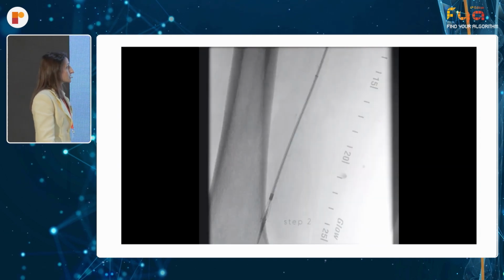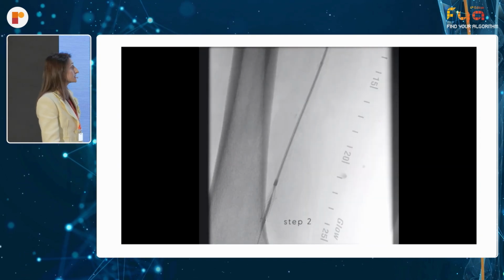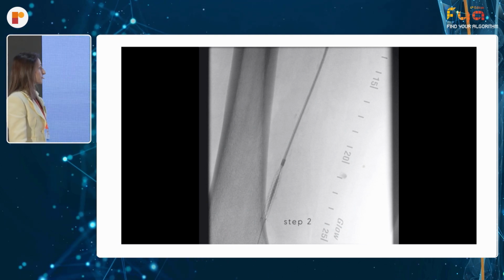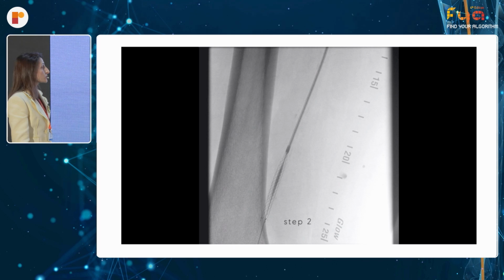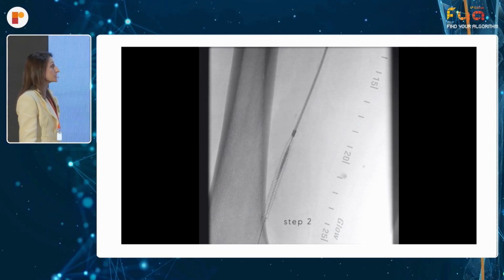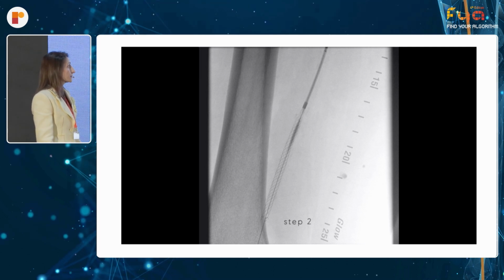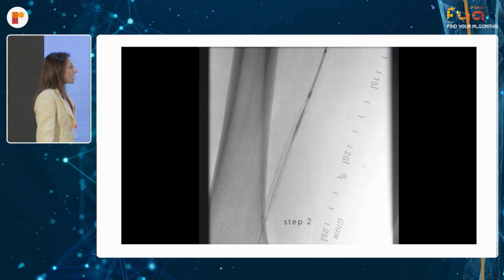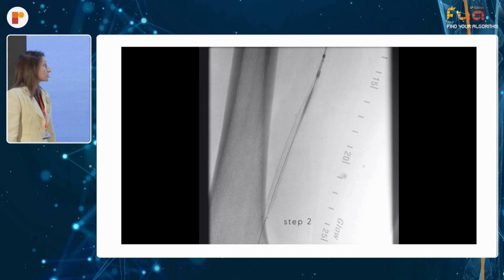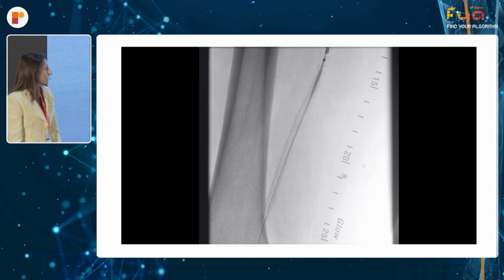And you will see the stent is really accurate during the deployment. It doesn't jump. But this stent also has the opportunity to reposition it if it is not fully deployed. Under 50% of the deployment, you can just recapture the stent in order to reposition it if you are not sure of the position or you just have made a mistake. So you will see how to do it.